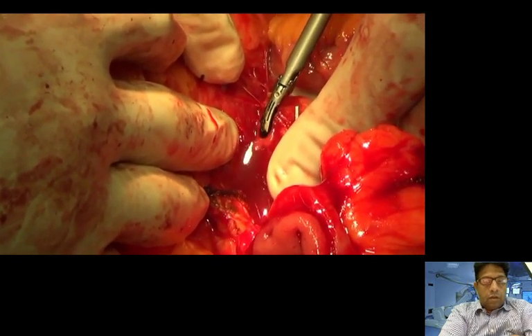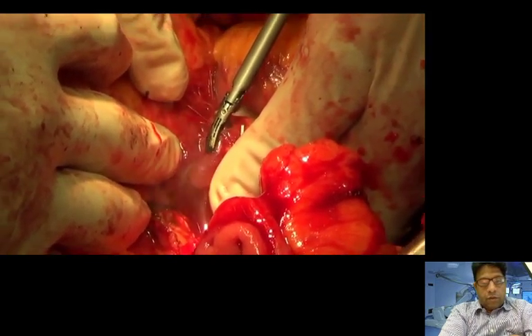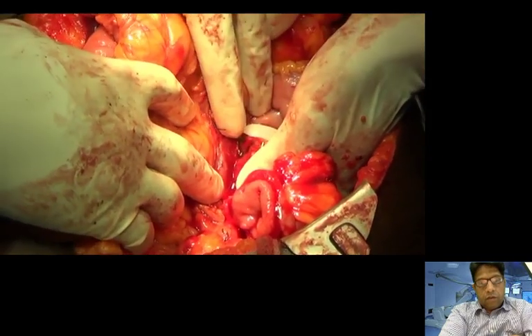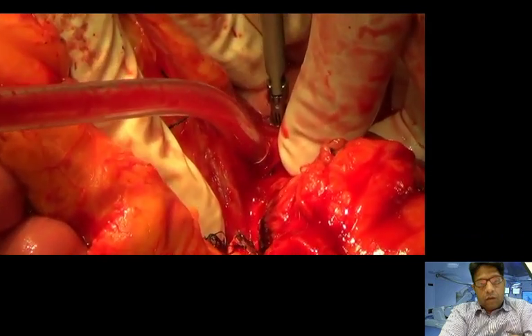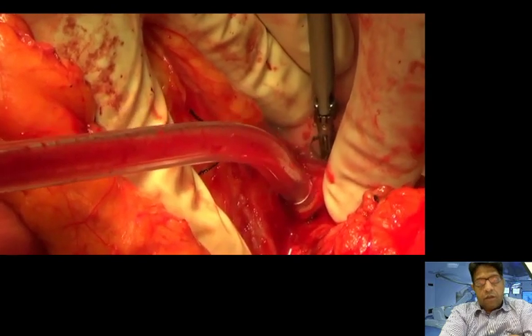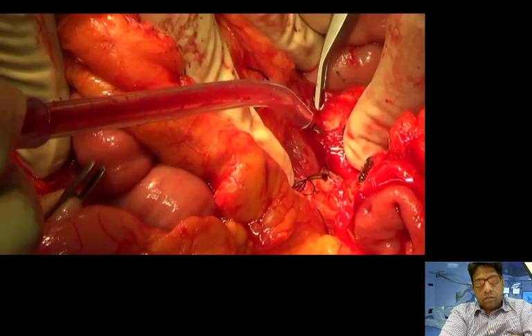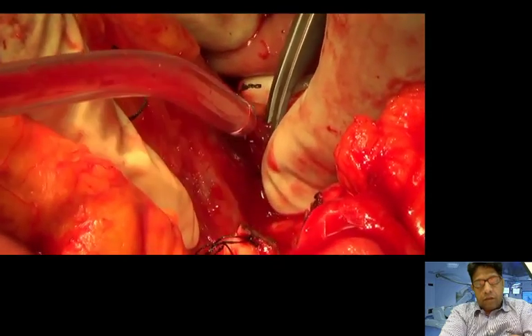Separate out the uncinate process of the pancreas, and the SMA. And there are some branches coming off the SMA, so a vessel sealing device is used. Clips applied.